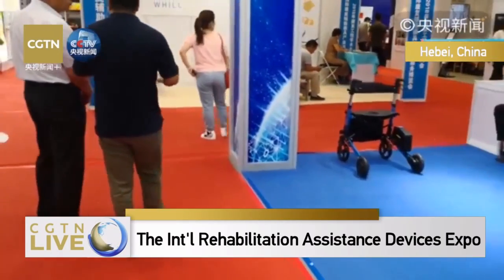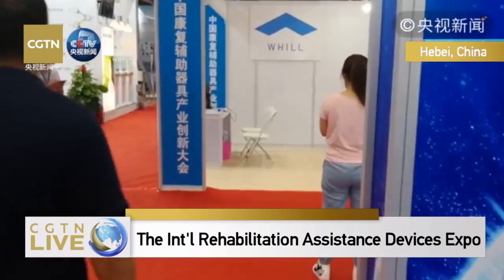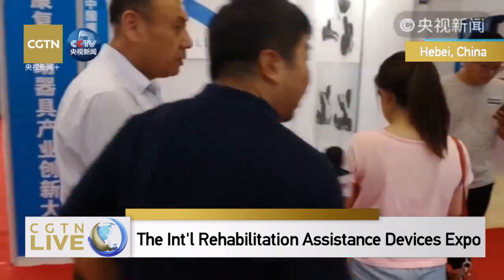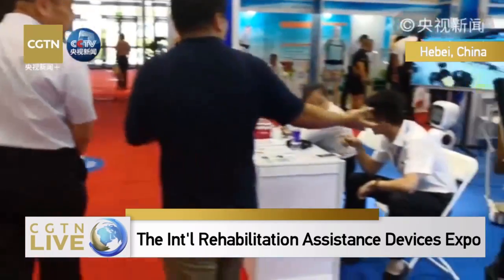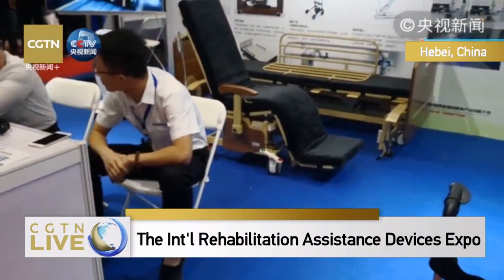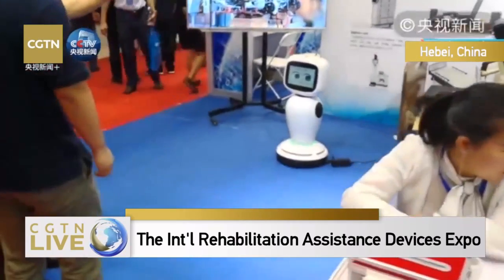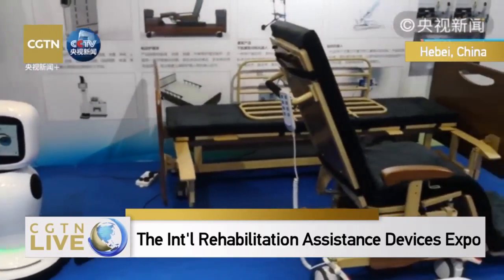What we observed are mostly used in rehabilitation centers. Only a few of them can be used at home. For those home use appliances, you will have to further lower the cost so as for the family to be able to afford. These are devices that can be used both at hospital or at home. It's a bed that can be turned into a chair. It also provides mobility assistance and comfort of resting.